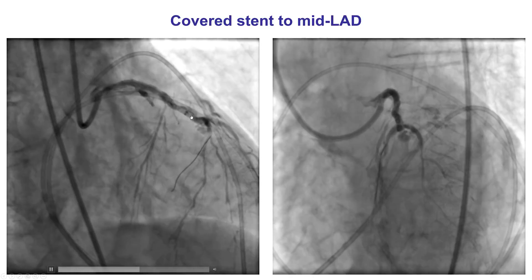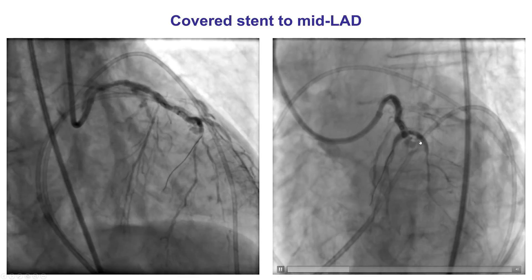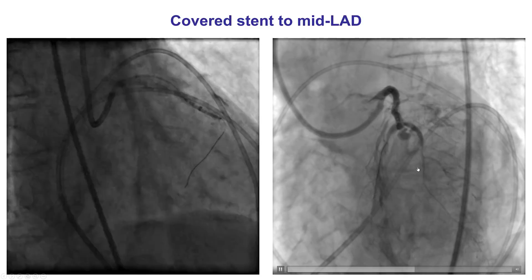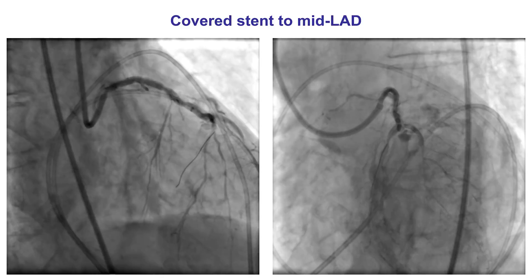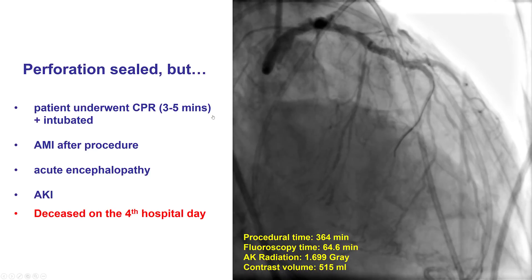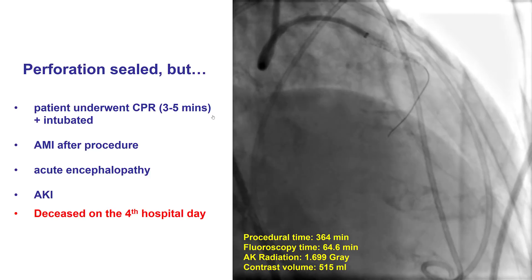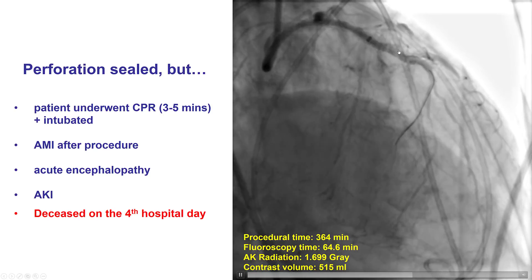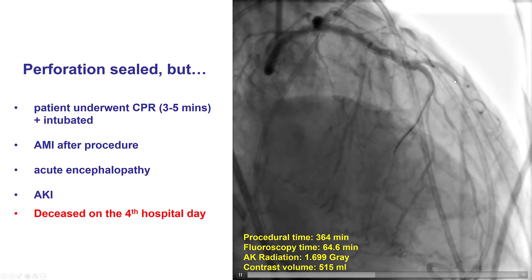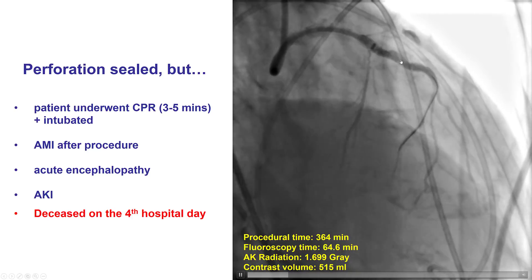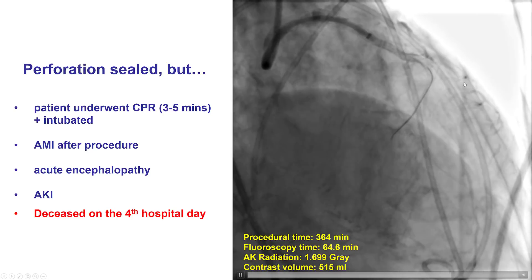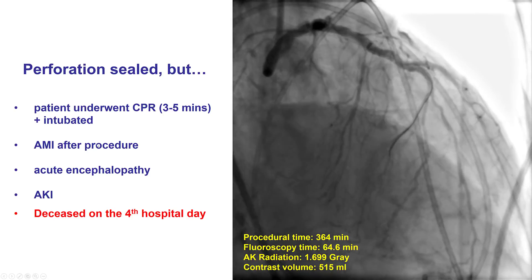Ideally you want to go further distal. We debated what to do about the large diagonal branch if we occluded it with the covered stent. But the patient was clearly bleeding into the pericardium with a large perforation that wouldn't seal, so we felt we had no choice. Using the shortest covered stent available, we were finally able to deploy it, and it did result in sealing of the perforation with TIMI flow into the LAD. However, we had jailed the origin of the large diagonal branch. There was still some flow in the diagonal, likely because sealing was not complete proximally, but it is quite likely the diagonal subsequently occluded, resulting in a post-procedural myocardial infarction.